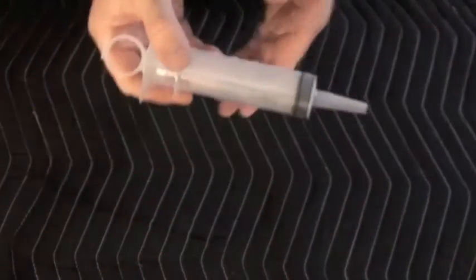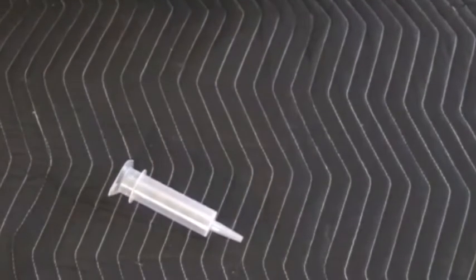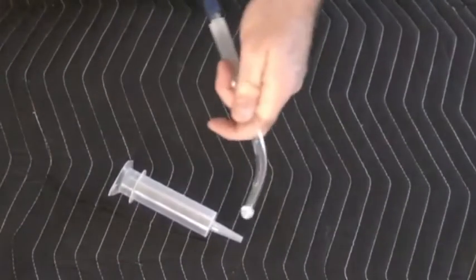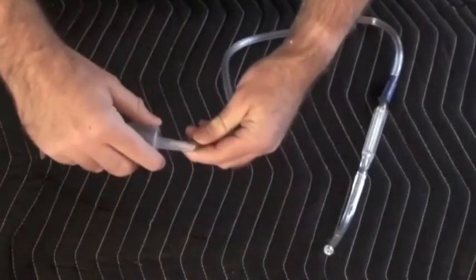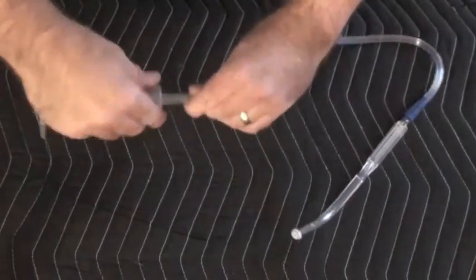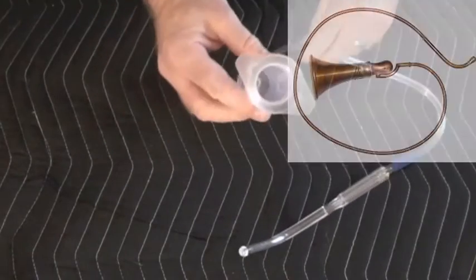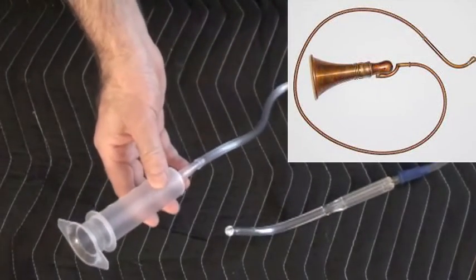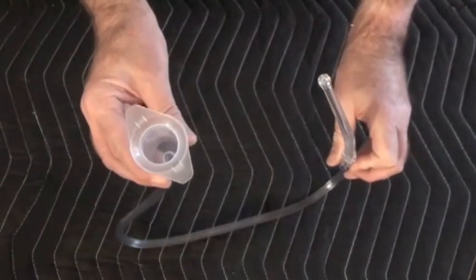Another fast and effective way to create a hearing aid involves removing the plunger from a Toomey syringe and attaching a short amount of suction tubing, that's important, short, to the end of the Toomey syringe with the Yankauer suction tip still attached. This is basically the resurrection of an antique technology called a conversation tube, which was in pretty common use before the invention of powered hearing aids. By speaking into the empty syringe, the sound is amplified and conducted to the Yankauer suction tip, which is comfortably placed in the patient's ear.